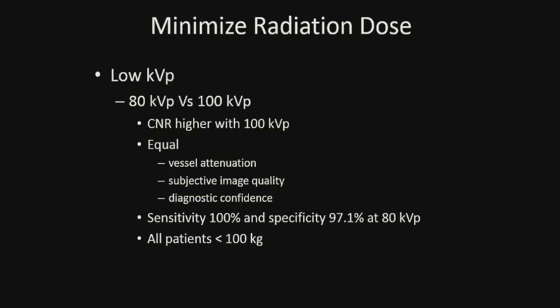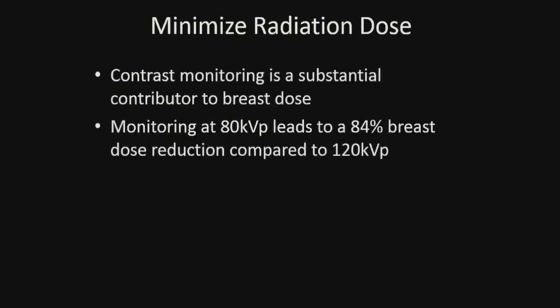In my department, we use 80 kVp for pregnant patients and 100 kVp for non-pregnant patients, and with iterative reconstruction, we're able to deliver CTs at a dose of less than 2 millisieverts with excellent image quality.